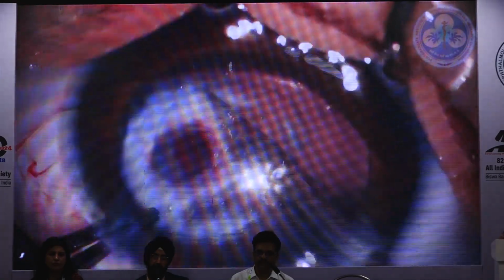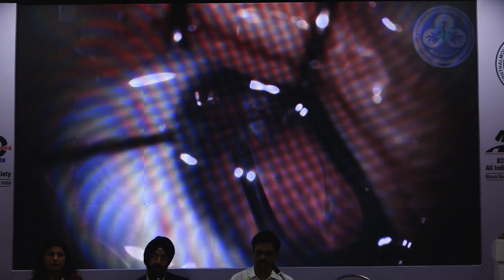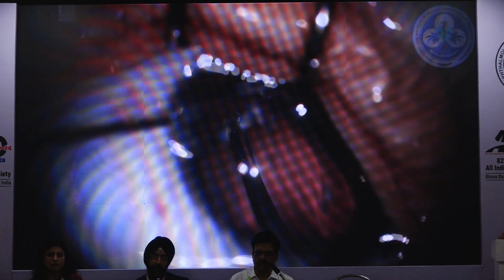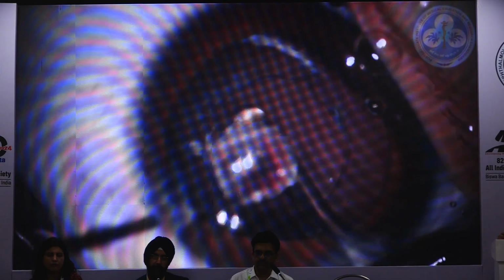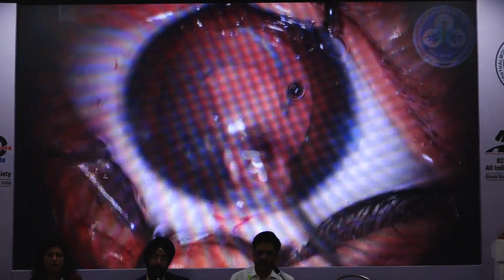Usually vannas scissors may help you because sometimes even cutter will not cut a thick membrane. Here it is just cutting of the stalk after cauterization and doing limited anterior vitrectomy.